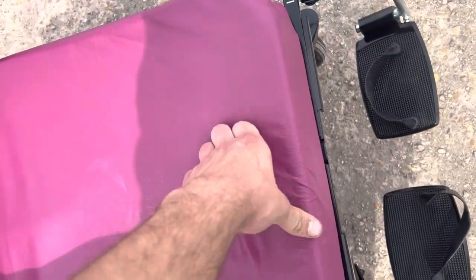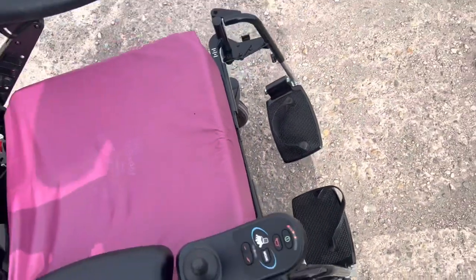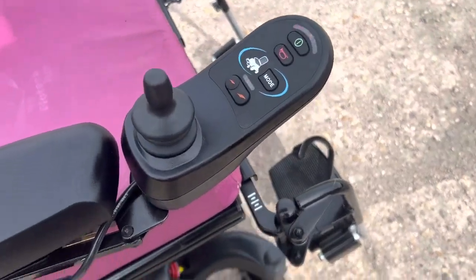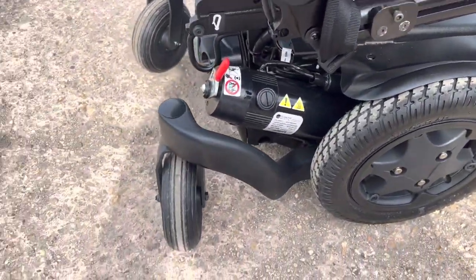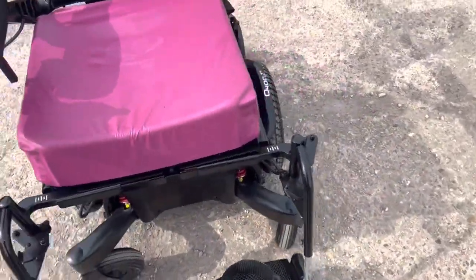It has nice cushioned, padded armrests. As a refurbished model it also comes with 55 ampere-hour batteries and this cushion. It's in really good condition — it's a 2021 model so it's hardly had any use whatsoever.